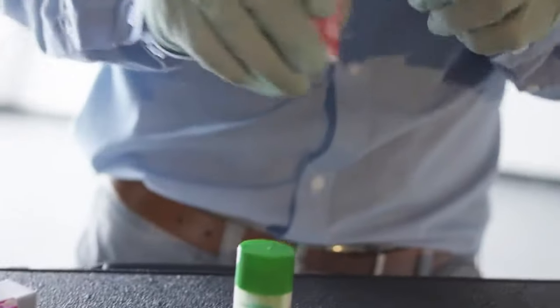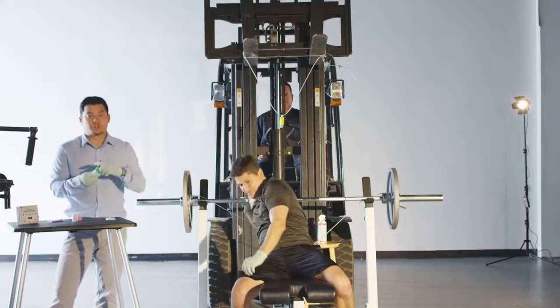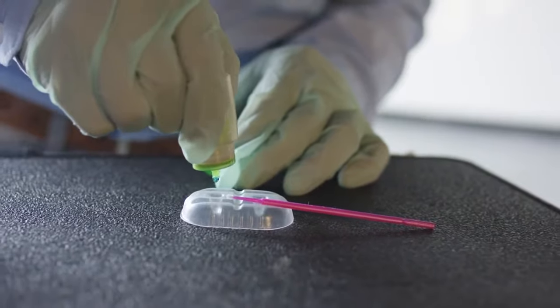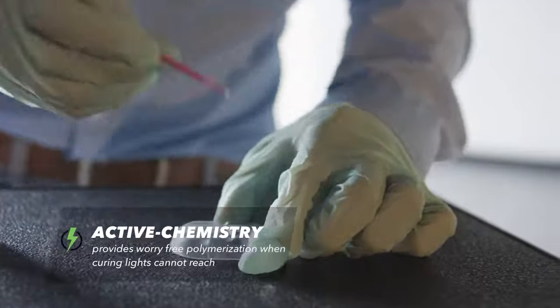Three easy steps: mix, apply, and air dry. One drop of Bond A, one drop of Bond B, and it's self-cured, so no light curing necessary, saving you on chair time.